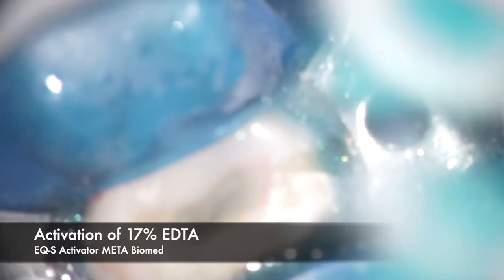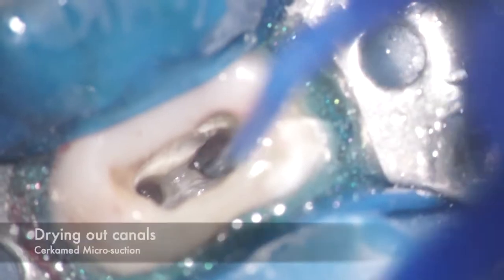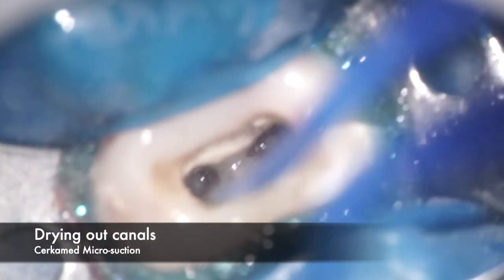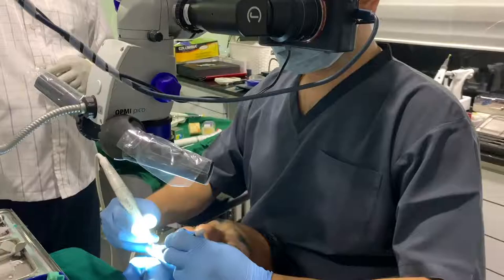Here I'm trying to first evaluate the position of the separated instrument using a DG-16 Explorer, after which we start to remove some of the inorganic debris possibly stuck around the head of the instrument, and trying to use micro suction to get a much clearer view of the head of the instrument.